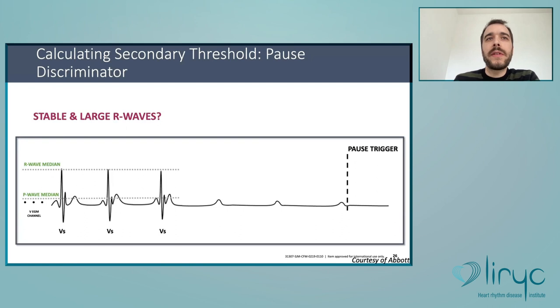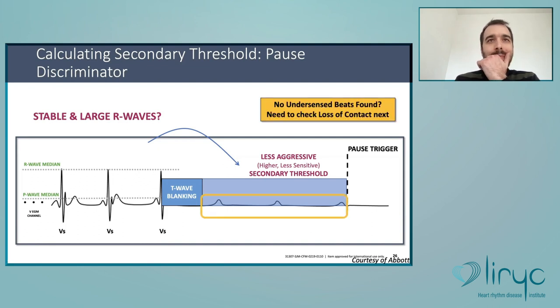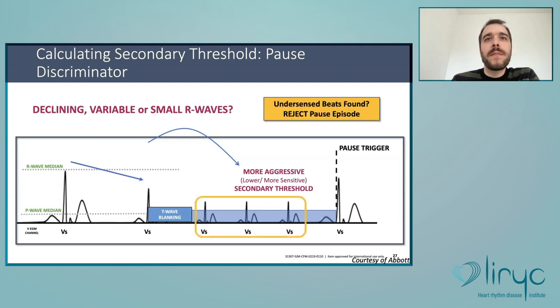If there are no undersense beats detected, then the device will check as a second step for the loss of contact. So this is the secondary threshold. It looks for undersense beats. If there is no undersense beat, then it looks for a loss of contact. For example, here you see at the beginning we have R wave variability, and then the device calculates the secondary threshold. It's a more sensitive one. And then it can detect an R wave in this window. So the pause episode is rejected.